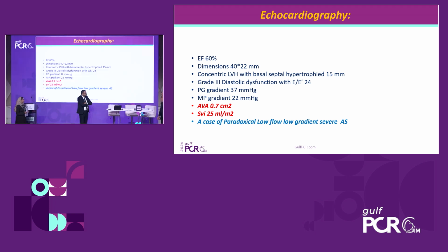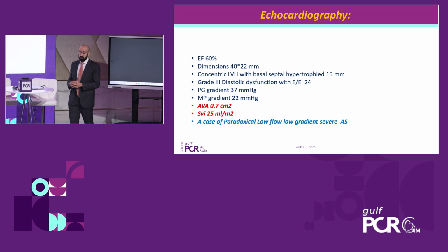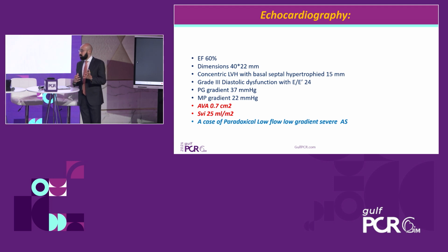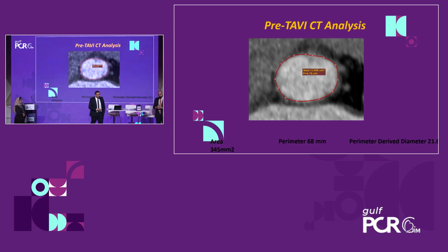Yeah, definitely a difficult case, because it's not the typical true severe aortic stenosis where, when you place the valve, they usually feel better. There are a lot of things ongoing, reduced relaxation and HFpEF as well, that will affect the patient. I think the choice of valve will also be very important. You will have a small annulus, and you will want to decide on the valve that will give you the best hemodynamics in this case. These are very important points, and of course, CT is crucial for planning such a procedure.